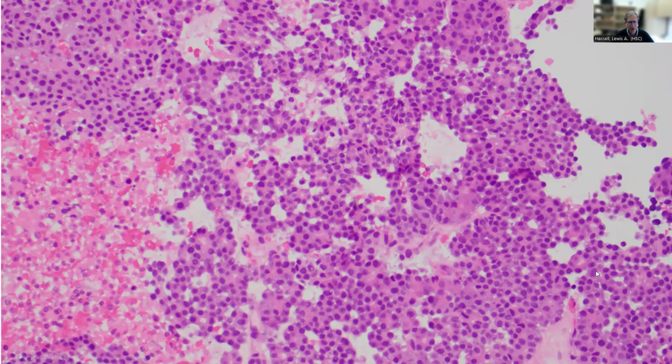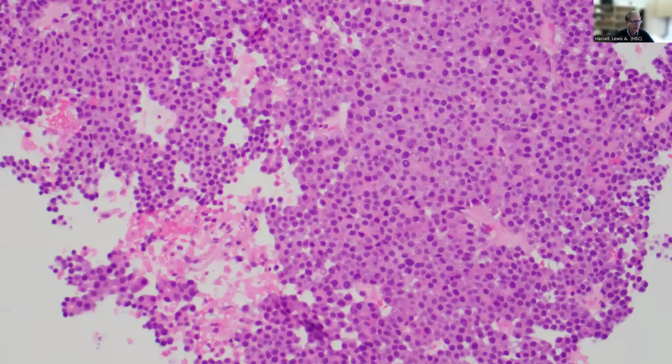And so it certainly fits the description of a proliferative neoplasm in this setting. And then here we can see again very mild pleomorphism, and then this loose vasculature in the background, but mostly just broad sheets of cells with that slightly acinar type of architecture.